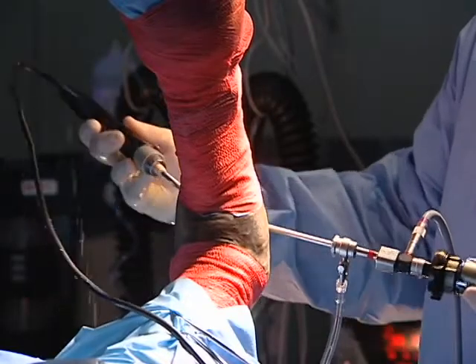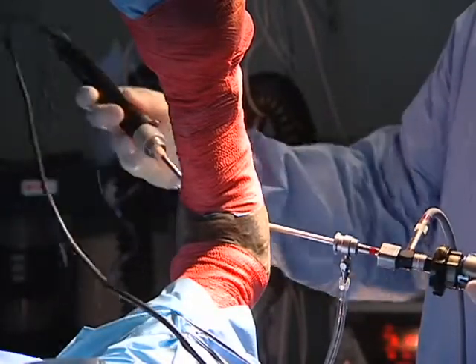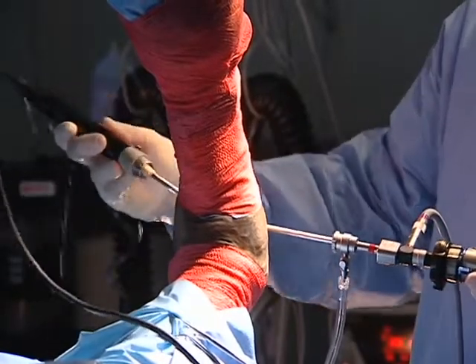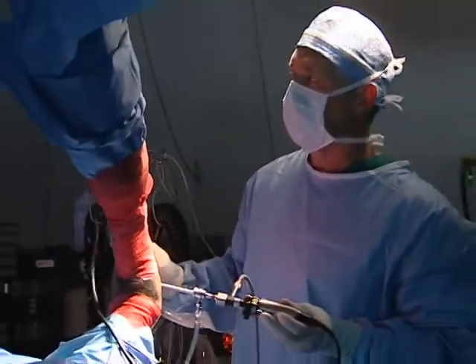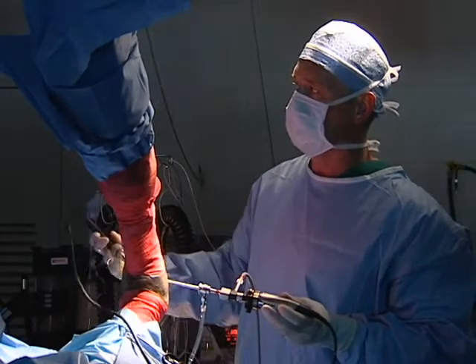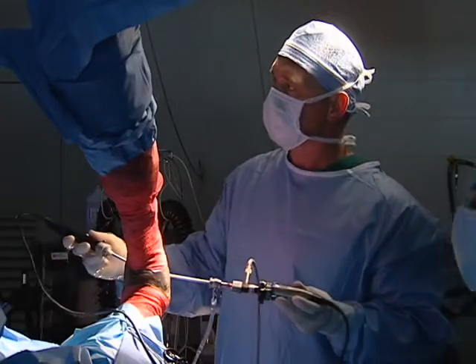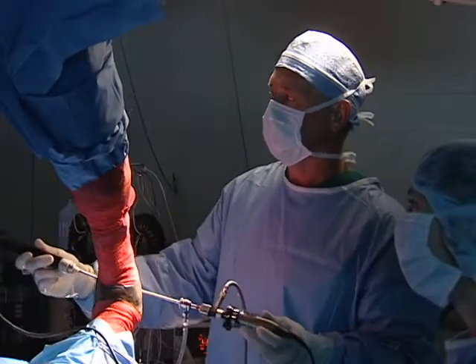This is just a mechanical burr. We call it an arthroscopic burr. It has several attachments. One that you can actually debride or clean up the cartilage in the underlying bone. This one is a synovial resector, basically a lawnmower. All I'm doing is trying to speed the process up. Some of this tissue, there's a fair amount that I'd like to get out of here. This just helps me do it a little bit quicker.